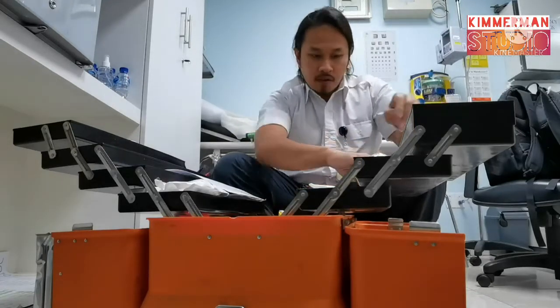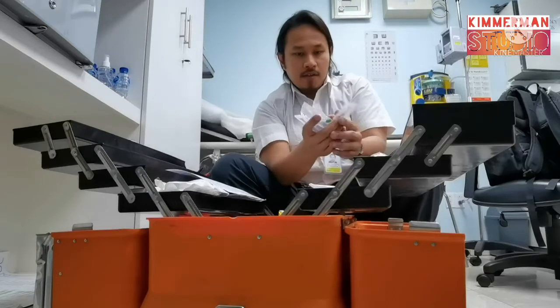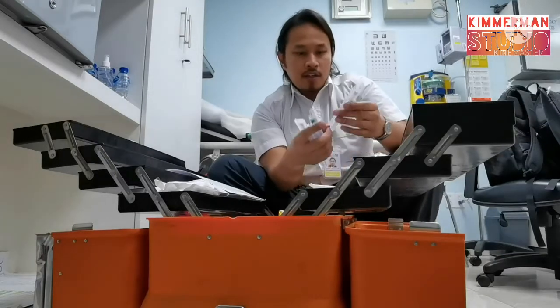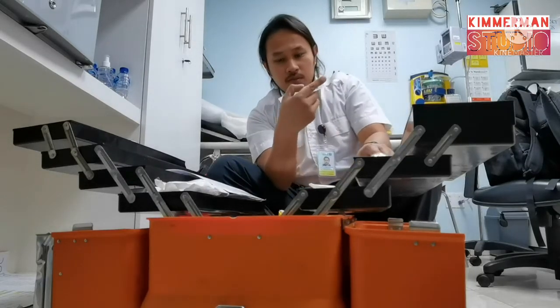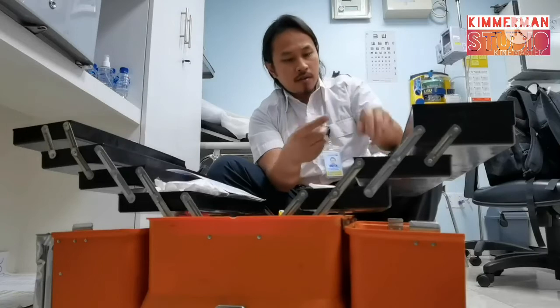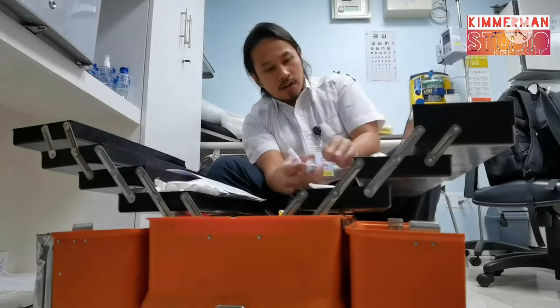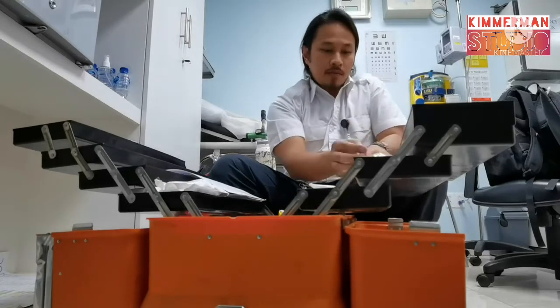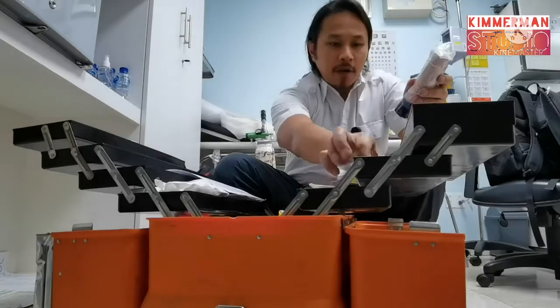Shelf 2, we have cannulas. So this is gauge 20, the pink one, and gauge 18, the green one. Let's check the expiration date. Not expired yet. Plastic bandages and paramedic shears.